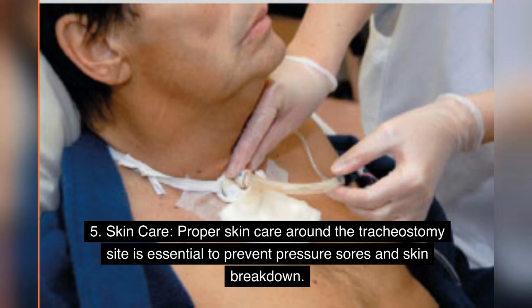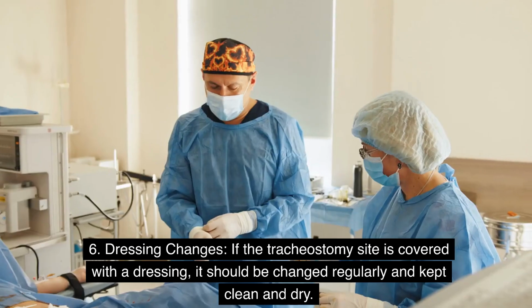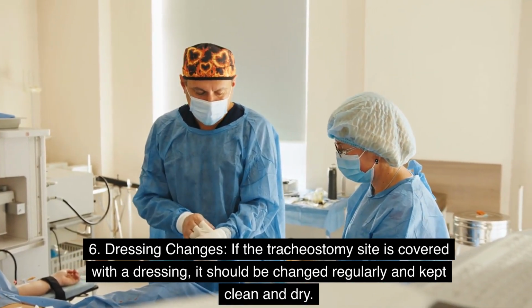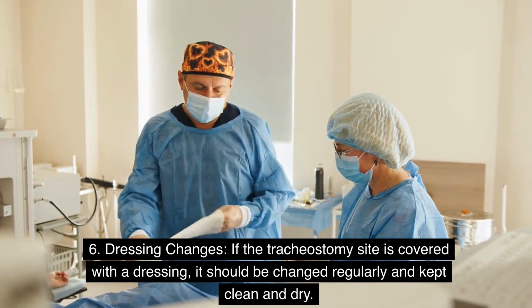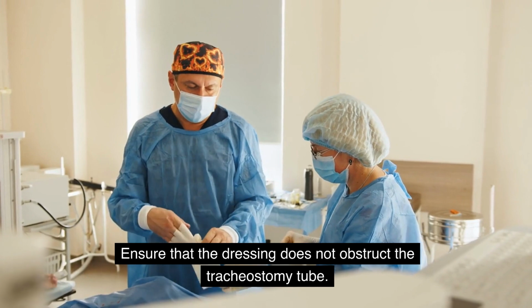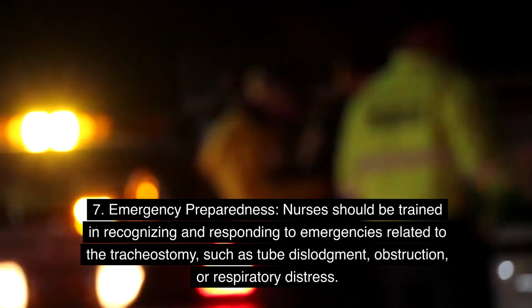5. Skin care. Proper skin care around the tracheostomy site is essential to prevent pressure sores and skin breakdown. Regularly inspect the skin for signs of irritation, redness, or breakdown. 6. Dressing changes. If the tracheostomy site is covered with a dressing, it should be changed regularly and kept clean and dry. Ensure that the dressing does not obstruct the tracheostomy tube. 7. Emergency preparedness.